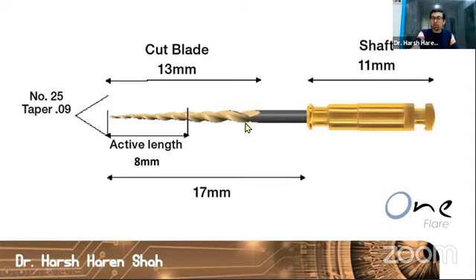After 8 millimeters, there is no taper. Another thing that you must remember when you choose a file for orifice widening is that you should not take a file which has a thick diameter. If you have a diameter which is thicker than 1 millimeter, there is a high chance of causing iatrogenic errors and especially of causing vertical root fractures because of loss of the pericervical dentine.